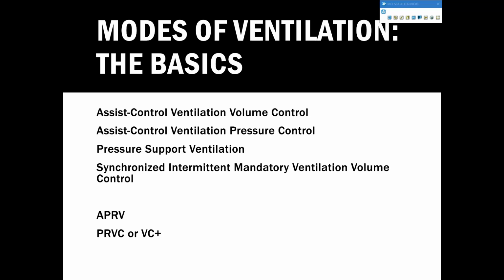But what PRVC or VC Plus is doing is it is going to take all the advantages of having that volume control. You're choosing the correct, perfect tidal volume for your patient. You're not going to overinflate them because you're choosing the perfect tidal volume. But when you have control of the volume, you have no control of the pressure, right? So sometimes on volume control, the peak pressures go up and up and up.